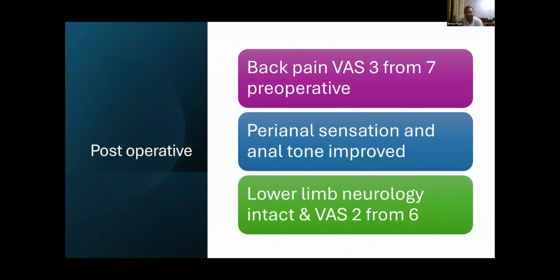Post-operatively, both the patient's back pain and leg pain improved: back pain from VAS 7 to 3, and leg pain from 6 to 2, and perianal sensation and anal tone also improved. So next, please.